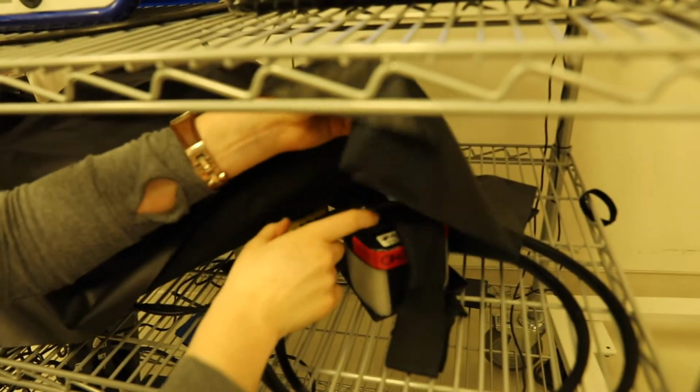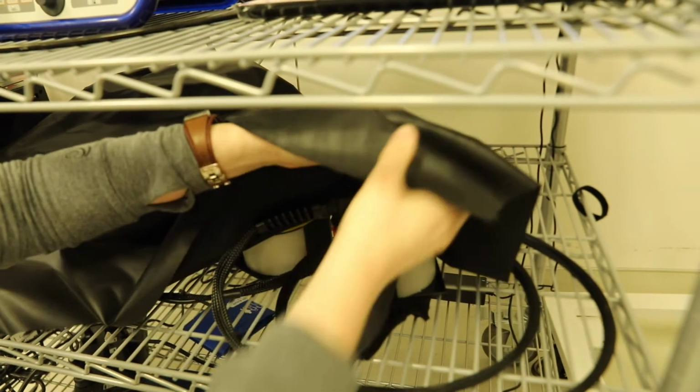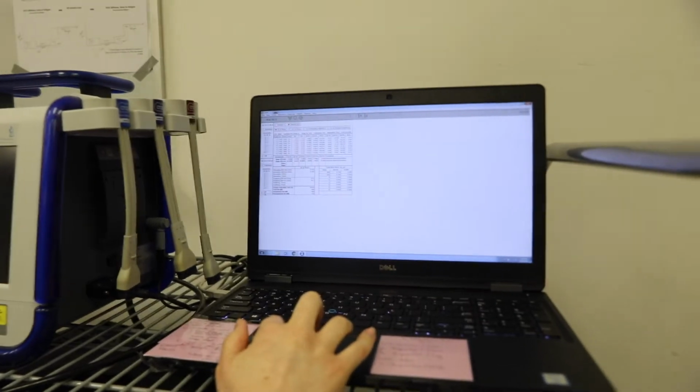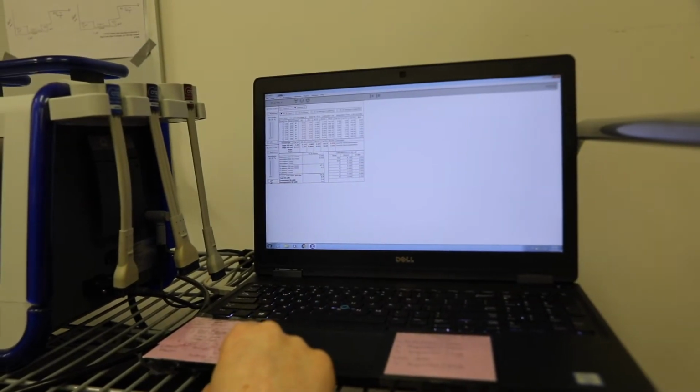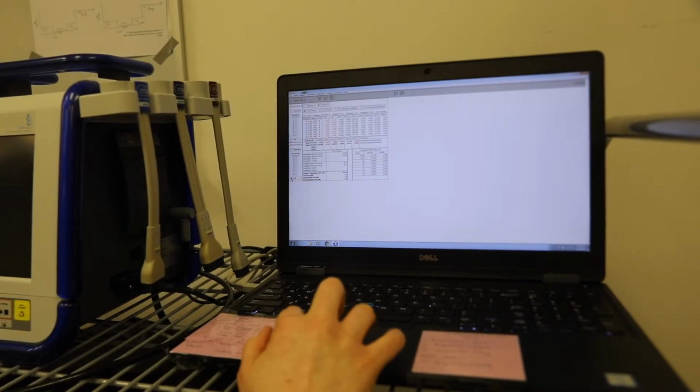Now we come back down here. We want to make sure that this probe B is sitting on our calibration block, the red block. You want to just make sure that you're holding it firmly on there. You don't have to press super hard, but firm enough that it's picking it up. And when you come back to the computer, click on the on button. When the black dot is filled in, it's now on.